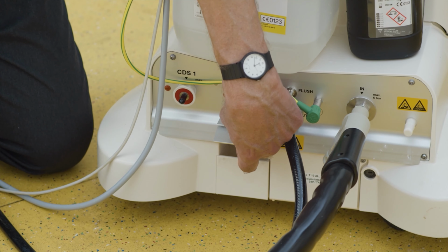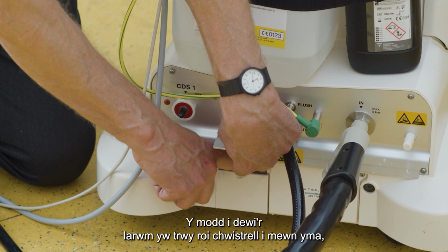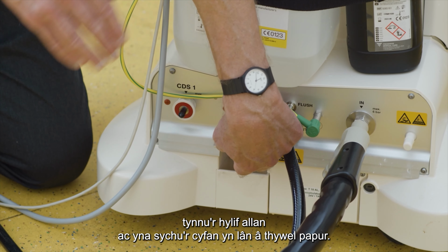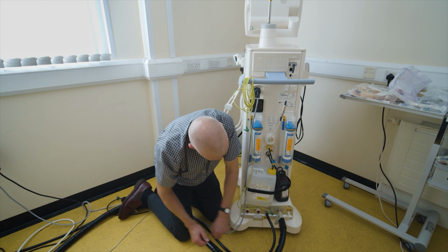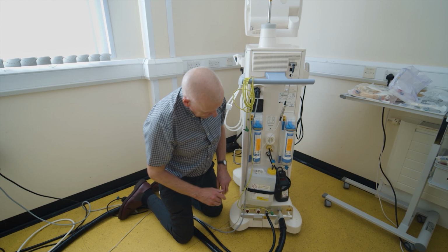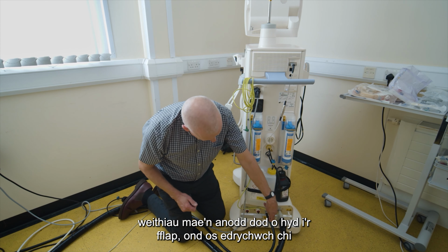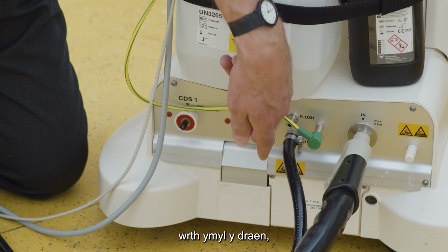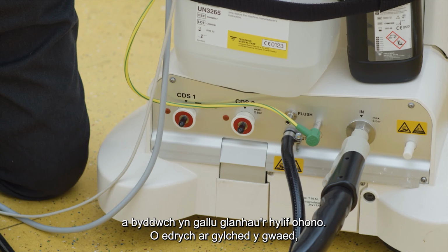The way to clear that alarm is to get a syringe in here and draw the fluid out, and then wipe it clean with a paper towel, close the flap, and the machine should be able to reset to clear that alarm. It's sometimes difficult to find this flap, but if you locate it next to the drain, under this point here, that little flap there will just lift up and you can clean the fluid out.